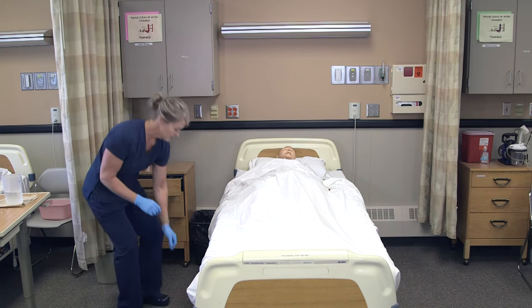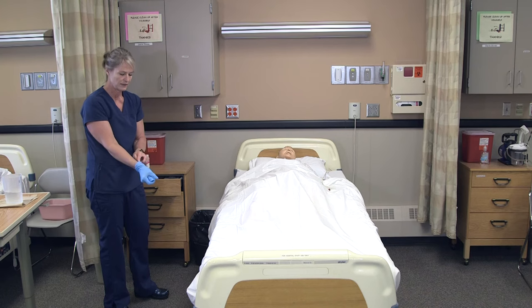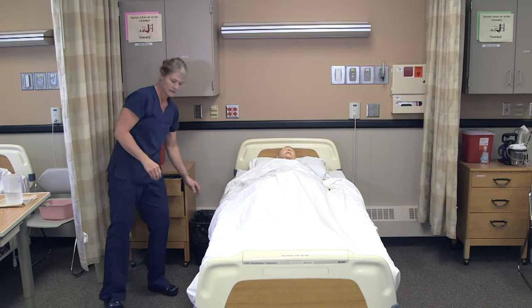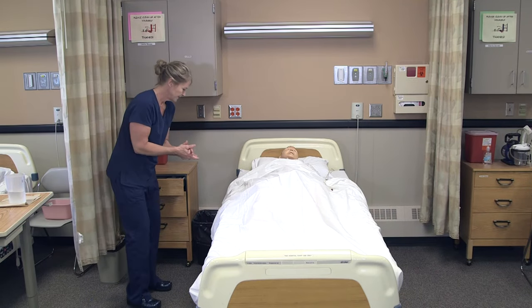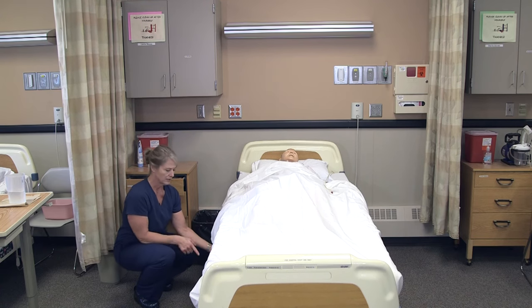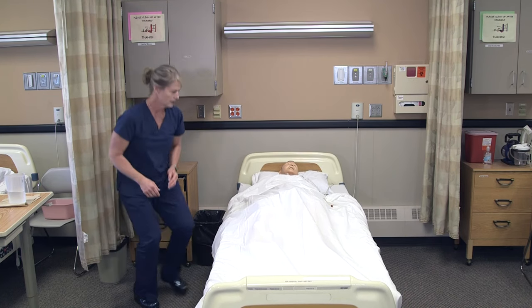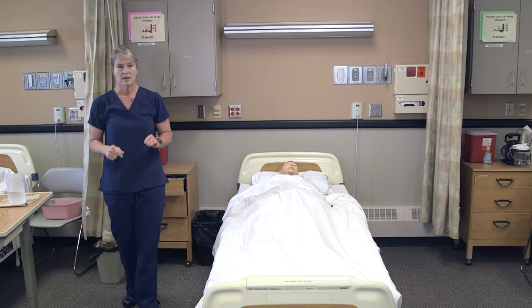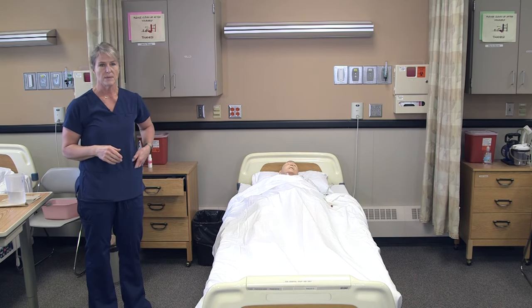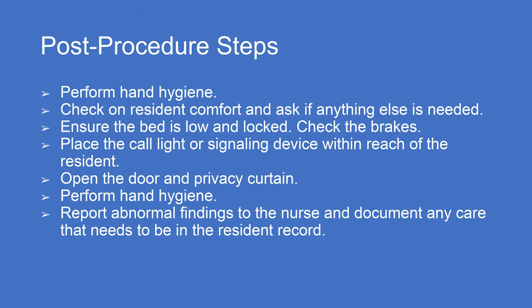My hands are dirty, so I can take the barrier up from the floor. Then I would remove my gloves and wash my hands. Are you comfortable, Lee? I'm going to bring your bed back down, making sure the catheter doesn't touch the floor. Check that the bed is locked — I see you have your call light there. I'm going to open up the curtain, and now that my gloves are off and my hands are clean, I can get my pen out and document the urine, then report anything to the nurse as necessary.